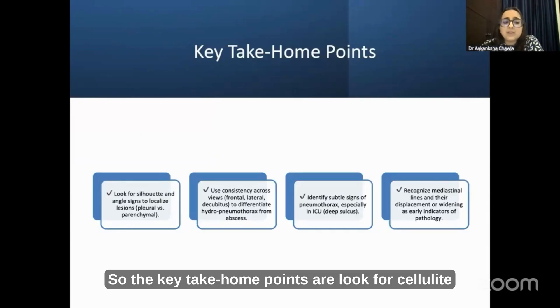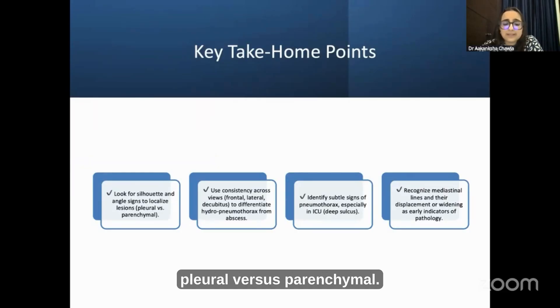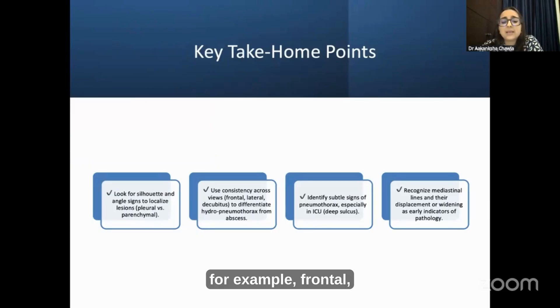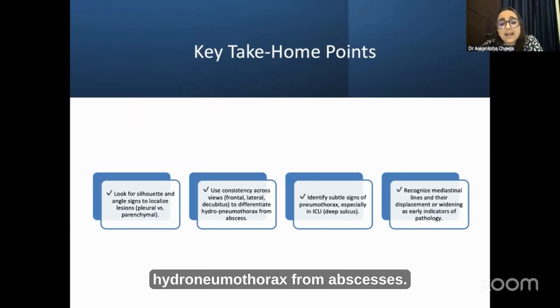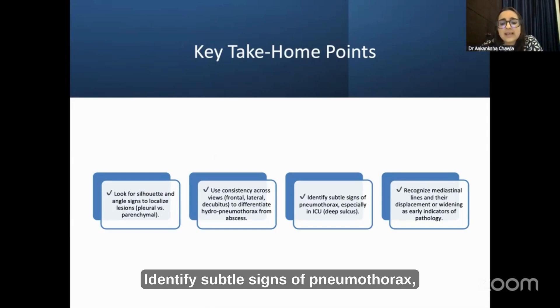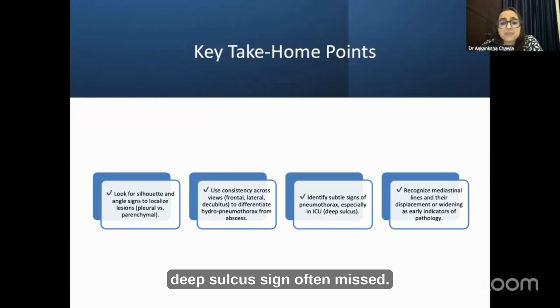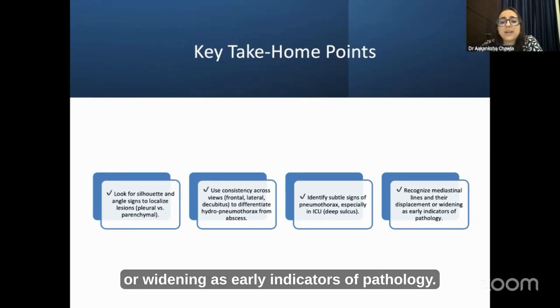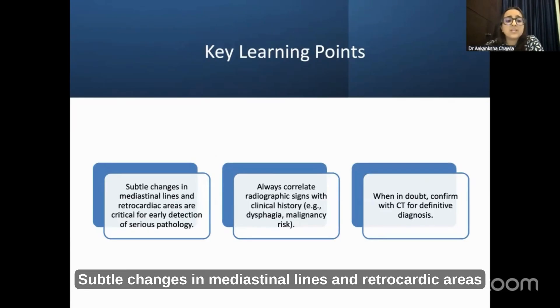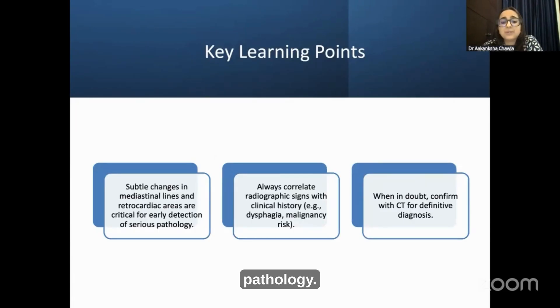The key take-home points are: look for silhouette and angle signs to localize lesions — pleural versus parenchymal. Use consistency across views — frontal, lateral, and decubitus — to differentiate hydropneumothorax from abscesses. Identify subtle signs of pneumothorax, especially in the ICU. The deep sulcus sign is often missed. Recognize mediastinal lines and their displacement or widening as early indicators of pathology.